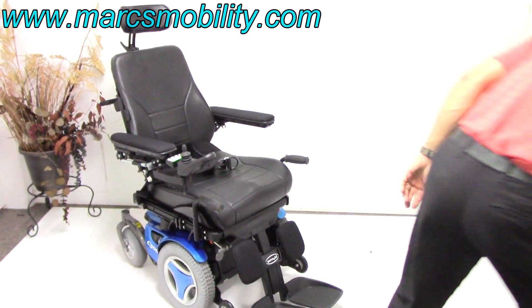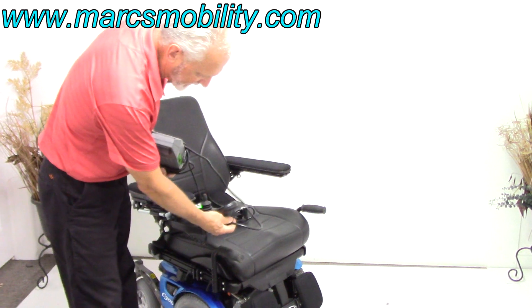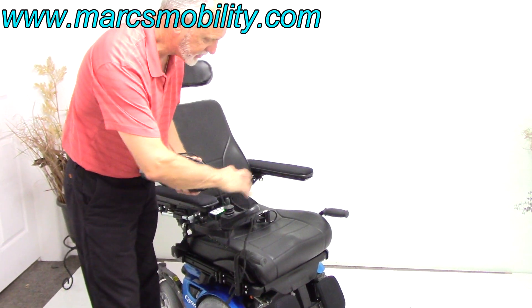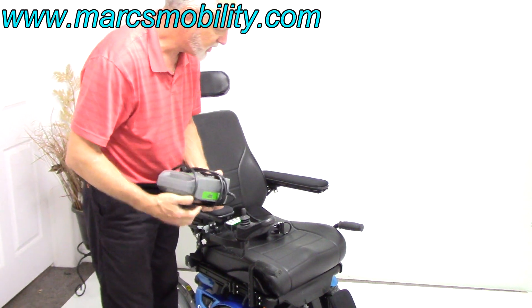To charge this chair, take your charger and plug it in over here. As soon as the light turns green, you're fully charged, so you don't have to worry about overcharging. The charger will start and stop charging automatically.